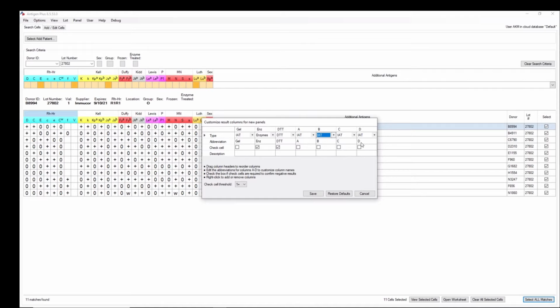So this might be the way, and then I got some extra columns in here, the way I've set it up, but you can set it up in any way you want. You can call this lists, and you can add some information at the bottom to make it more specific. But once you set it up, that's the way it opens up for everyone. But once you're in a work or in a job, you can take some of these out. You can add new ones. You can do a lot of things.